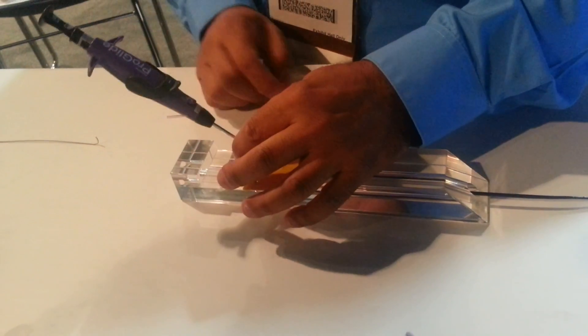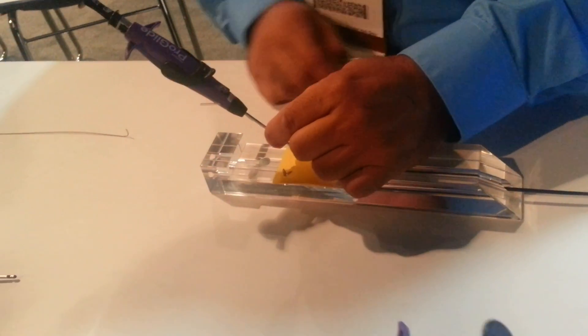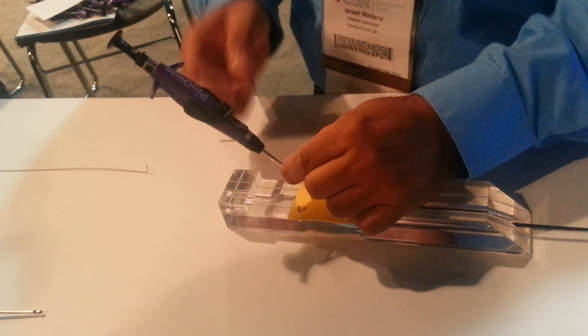45 degrees with the other hand, and we're going to advance the device all the way in. For purposes of this demo, we want this elbow to be all the way in. What will happen in real life is you have a port in here that's on the elbow. You will have pulsatile flow coming out of this side over here — that's when you know you're in the right spot.